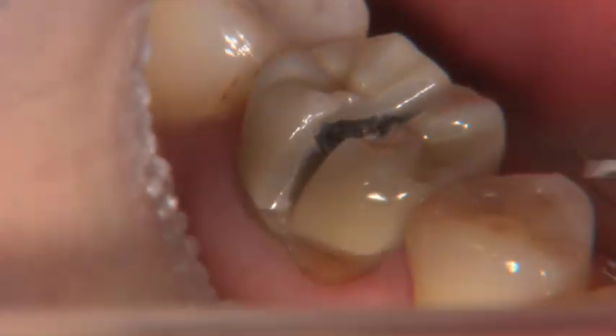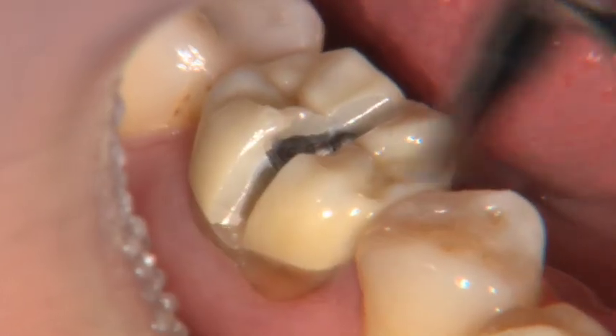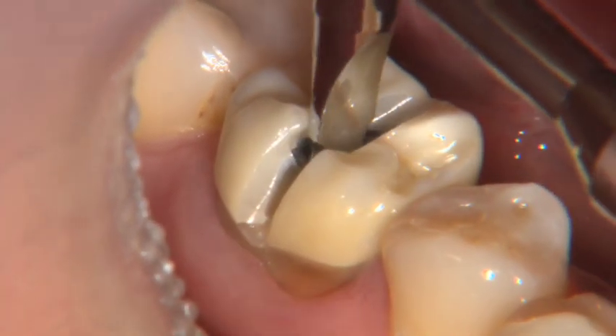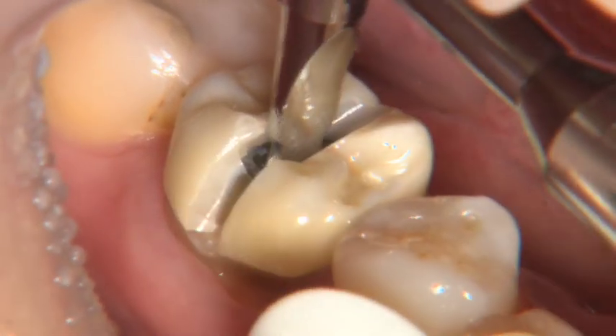Now that I've gone all the way through the buccal and the occlusal, I'm going to take my Christensen crown remover and actually go inside of here. That slot's a little wider than I'd want it to be from that wide diamond, but the wide diamond was more efficient.